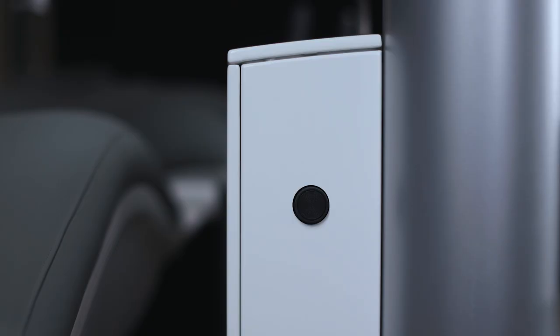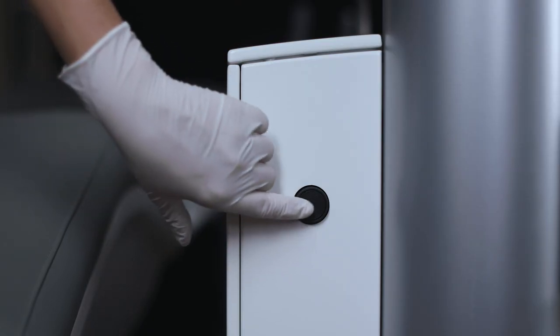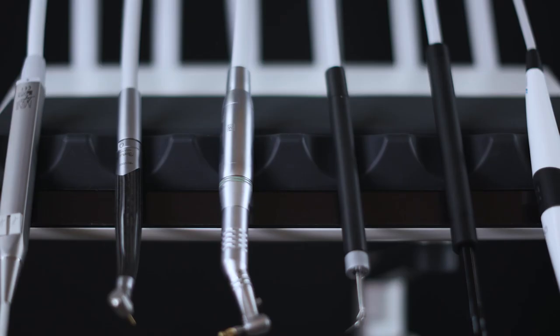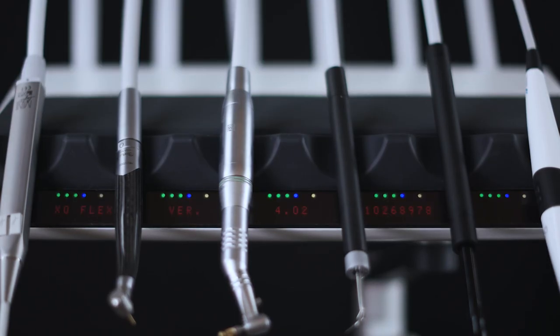To operate with the foot control, switch the unit on using the main switch. The unit is ready for use after a few seconds when the text XO Flex is shown on the instrument bridge display and you hear the welcome tune.